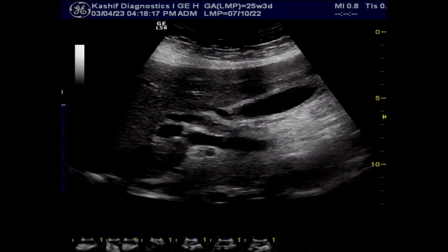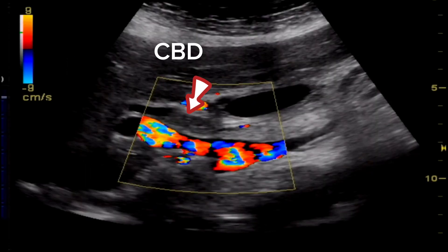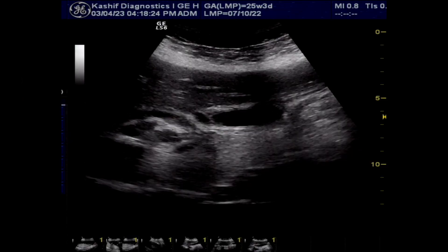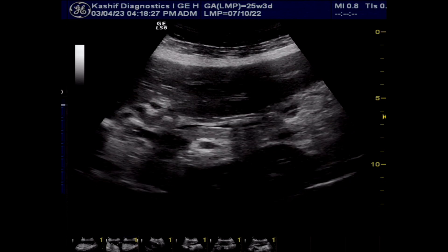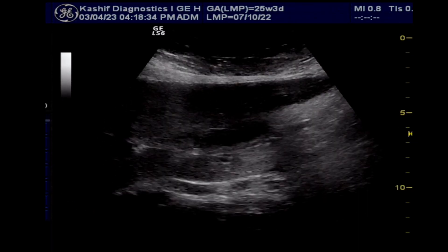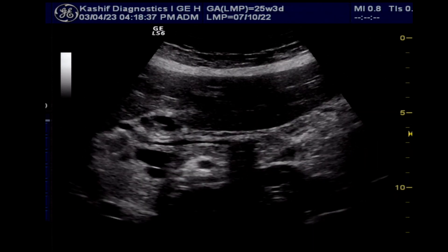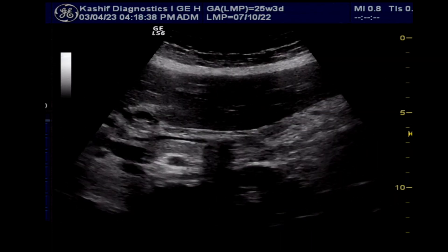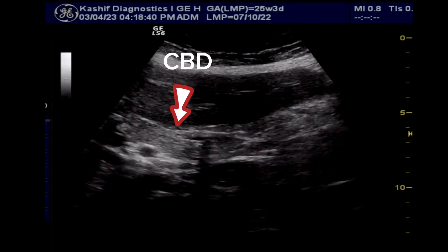The CBD is visualized in the lateral position and is dilated. The pancreas is visualized and is normal. If we further trace the CBD, you can see two small calculi in the mid to distal third of the CBD.